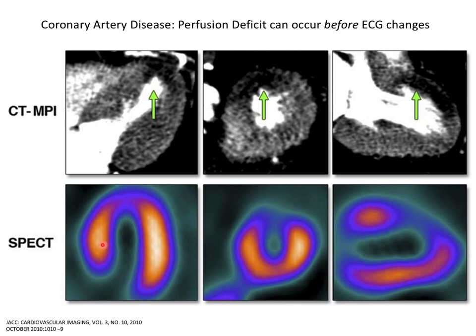A similar view with nuclear medicine, which we looked at on Tuesday, looks like this. They're kind of blurry, but the brightness corresponds to the agent getting into the tissue. In this case, it was a SPECT agent, probably technetium-99. In the short axis, what should be a pretty symmetrical donut no longer looks like a symmetrical donut. That's a perfusion deficit, and on the anterior wall, there's the critical perfusion deficit.